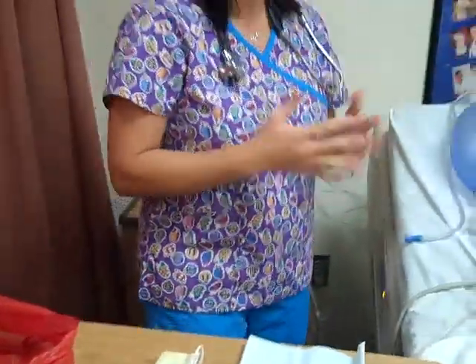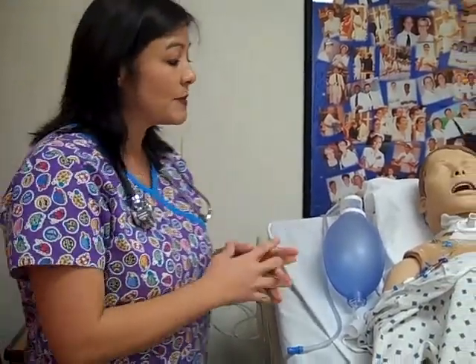Before I start this skill, I'm going to go ahead and wash my hands, gather my supplies, and introduce myself to my patient and explain everything I need to about the skill. You will also want to do a respiratory assessment on the patient, looking for indicators of why a patient would need suctioning.